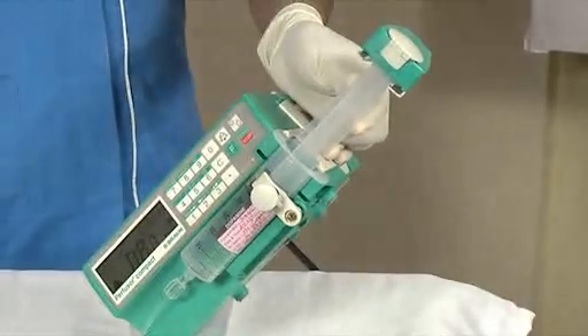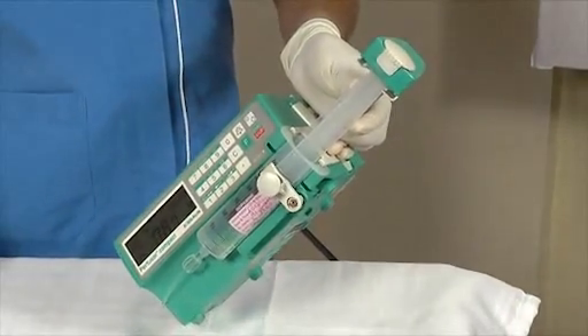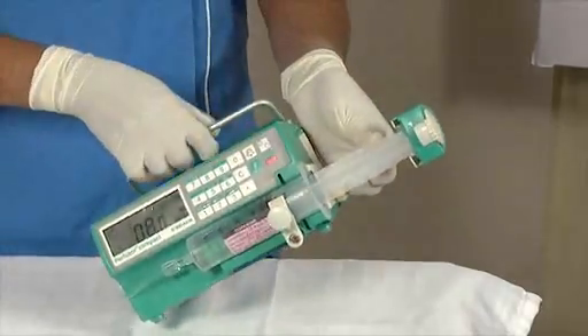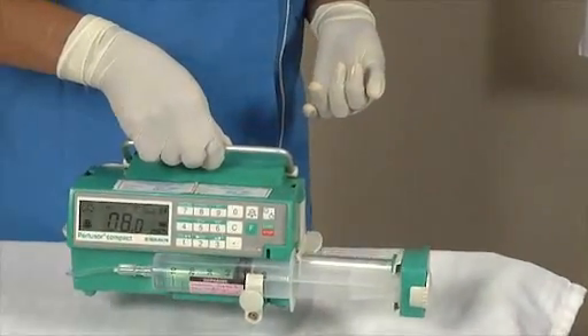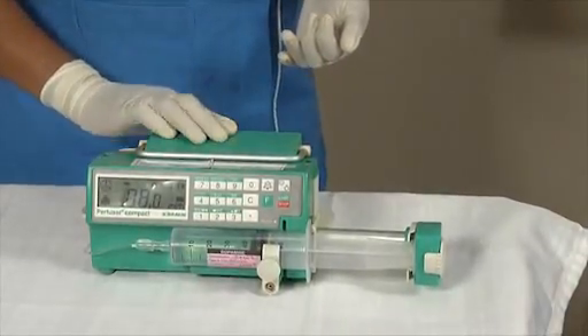Handling the syringe pump. Do not carry the syringe pump using any part of the syringe piston. This is rough handling and can damage the device. Always use the handle on the top of the syringe pump to carry it and place it gently on a flat surface.